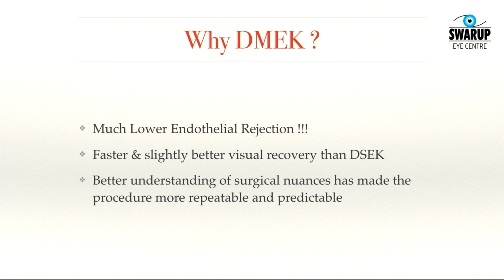I think the very compelling reason to be doing DMEK is because the graft rejection is much, much lower, almost 1/5 that of DSEK. It's faster and has a slightly better visual recovery than DSEK. And with time, we have understood how to do the procedure better. Some surgical nuances have been understood. We've learned how to tap and unfold the tissue better. So with all those things, the surgery has become a little more repeatable and predictable, and thereby the outcomes have started getting much, much better. So these are the reasons why one should start doing DMEK.